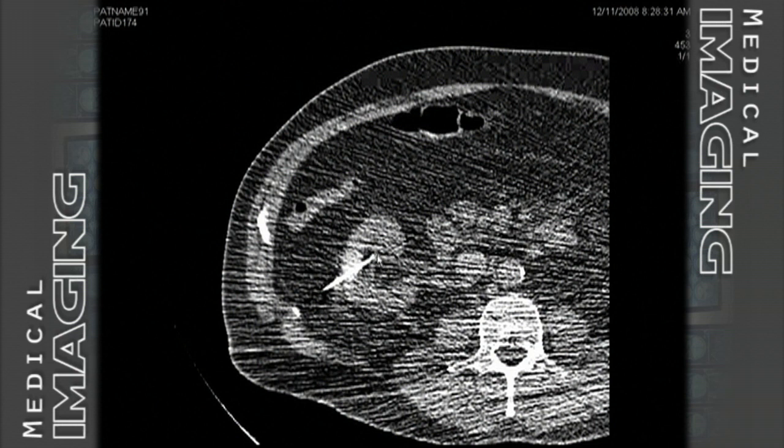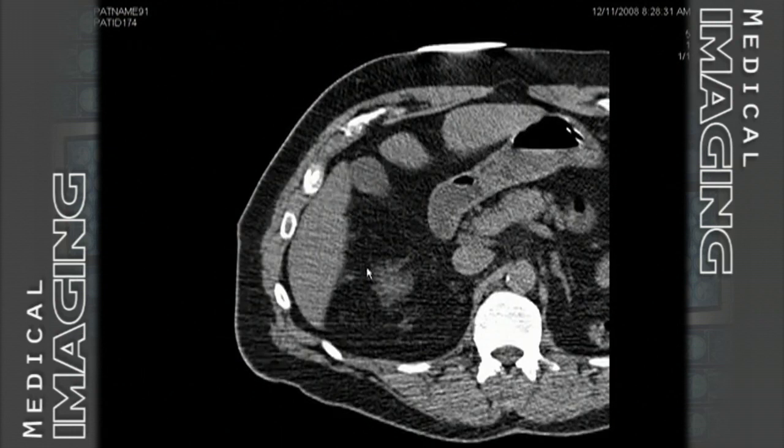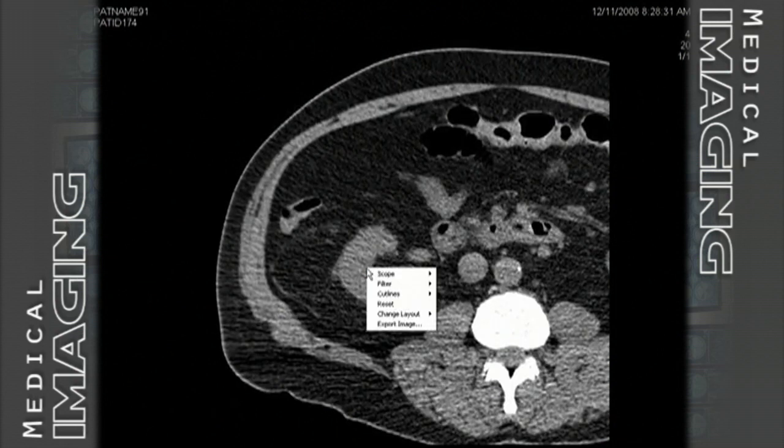So the role of the CT technologist here is critical to demonstrate and assist in viewing the success of the progressive images that will guide the radiologist to proper placement of the probe. The probe has been inserted, of course, and the cryogenic probe inserted. All these are subsequently withdrawn, and the subsequent scans monitored days later will evaluate whether the intervention was successful or not. This area around the kidney may show some further inflammation, and that of course will be watched, as well as the patient's urine and vital signs to see how well they tolerated the procedure.